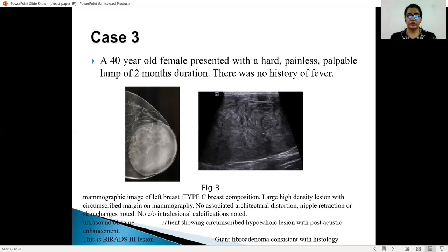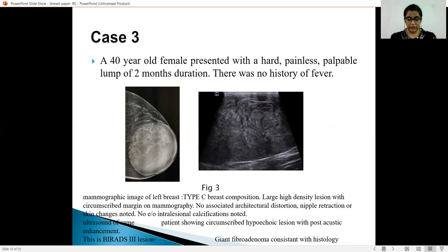Case 3: a 40-year-old female with a clinically palpable lump for 2 months duration, with no history of fever. The mammographic image of the left breast shows a high-density lesion with circumscribed margins, and no associated architectural distortion, nipple retraction, or skin changes. No evidence of intratumoral calcifications was noted. The ultrasound image shows a circumscribed hypoechoic lesion with posterior acoustic enhancement, given a BI-RADS category 3 for possibility of fibroadenoma, which came out to be a giant fibroadenoma.